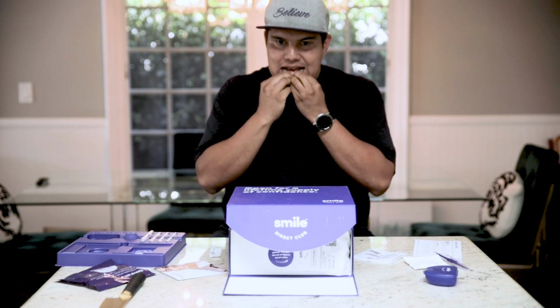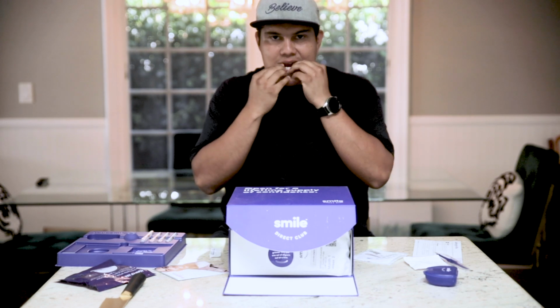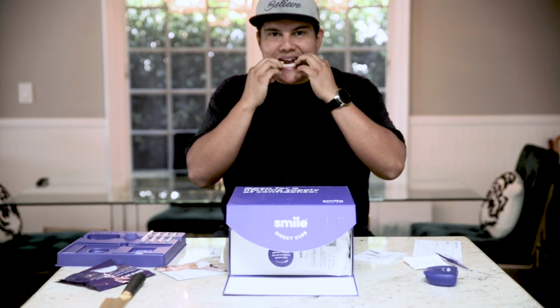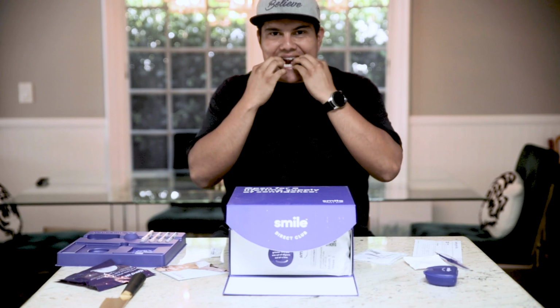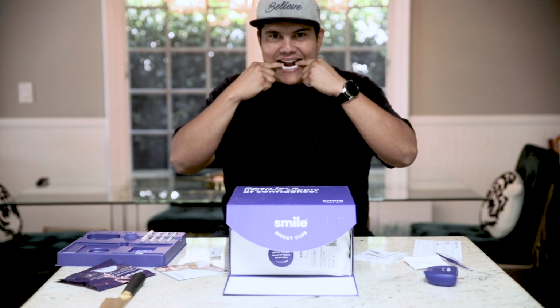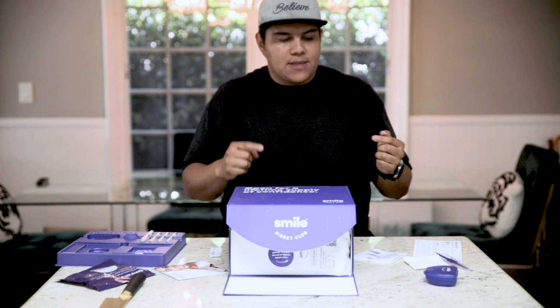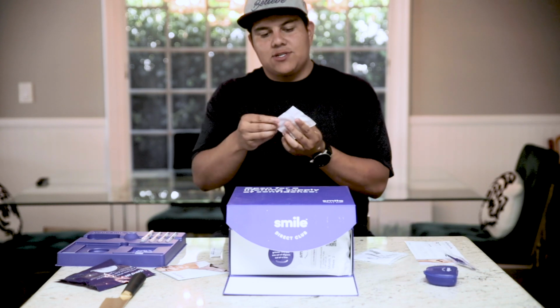Same thing. Front ones first. Then each tooth. Oh, it's tight. Cool. Super tight. And now I'm gonna do the chewies.